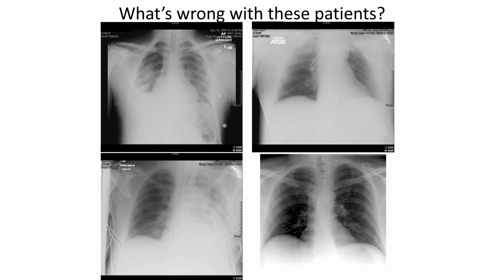The one at the bottom right is just taken off the internet. It's a psychiatric patient who has swallowed a butter knife. You can probably see the outline of the butter knife clearly in the esophagus there. And that is a suboptimal situation. But the rest of these actually come from my trauma surgery days.